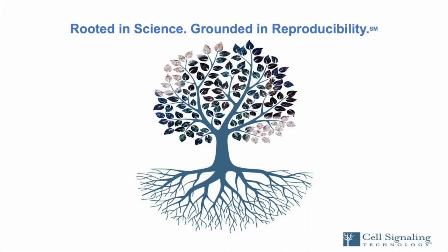Yeah, I think that using a concentrated antibody gives you more control over your assay development and optimization. So for example, if you buy a ready-to-use antibody and you happen to run a protocol where that antibody looks very weak or you're getting no signal, there's not much you can do there. I mean, you can mess with your protocol to try to get it just right, but you can't really change the concentration of the antibody, right? Because it's already diluted to what the manufacturer thinks is the optimal dilution. But like I said, that may not be the optimal dilution for your assay specifications.